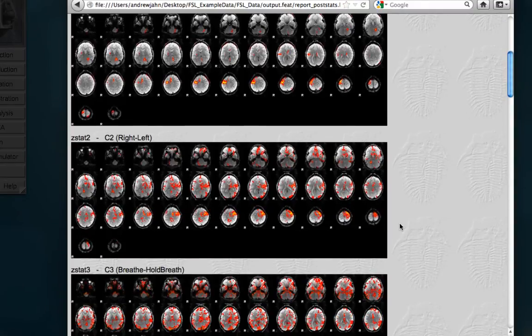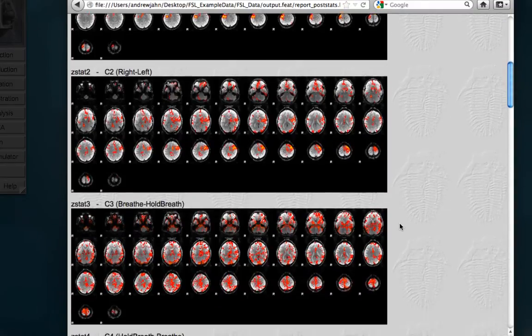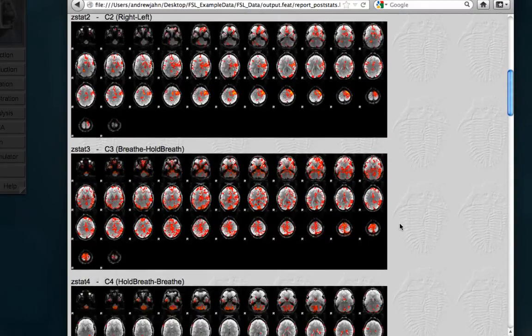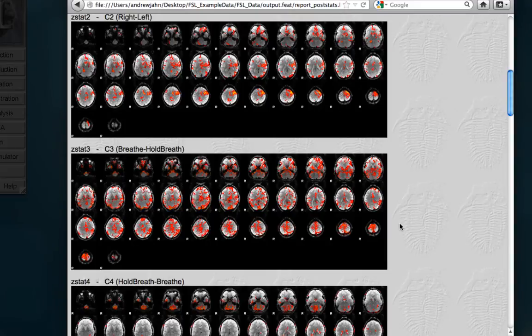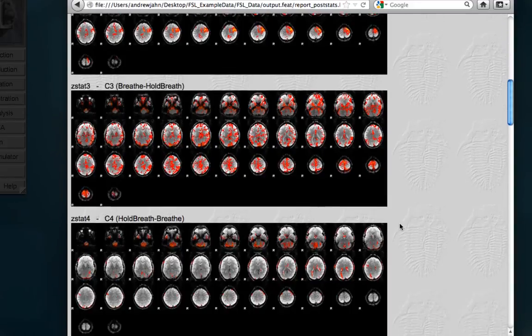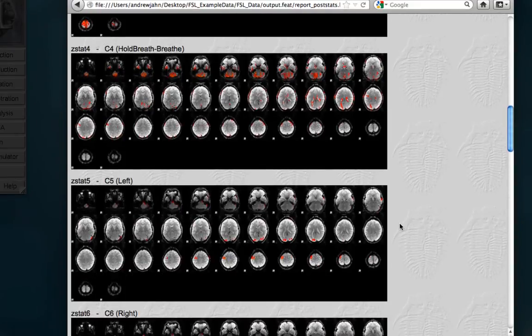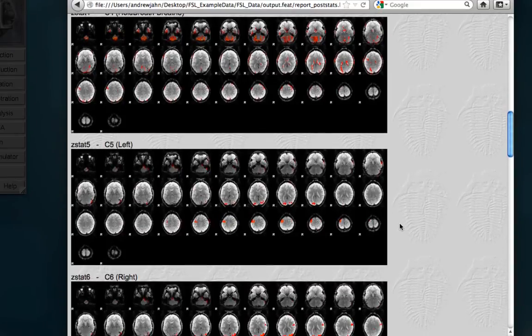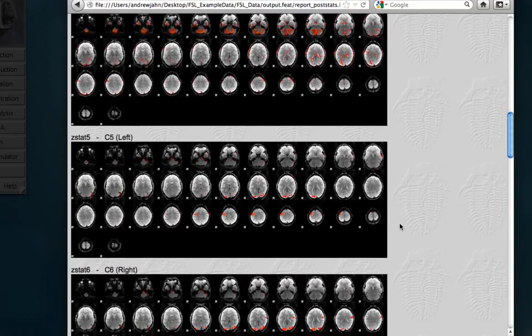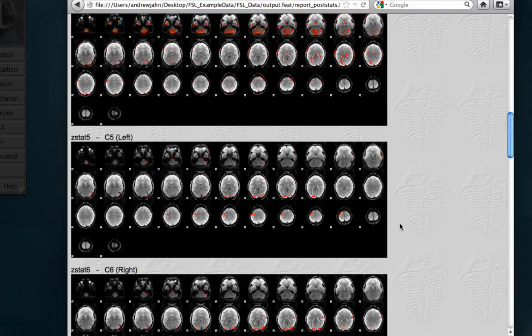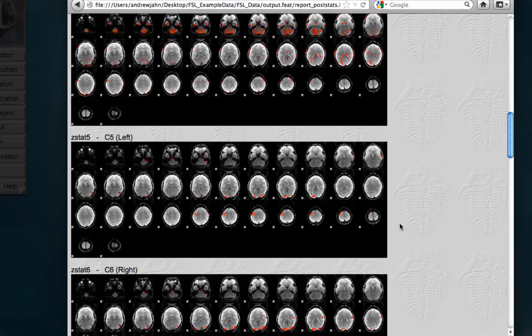So, we can go through here. Remember, there were eight contrasts that we did. Four were differential contrasts, and four were just simple effects. But go through them, make sure it looks reasonable, and also keep in mind that even if there are maps that don't seem to have any activation, remember we had a Z threshold at a certain height. So, it really helps you and behooves you to look at the actual Z maps when looking at these results closer.